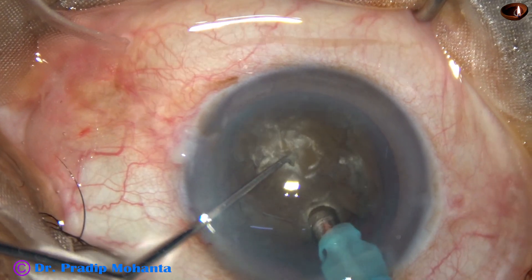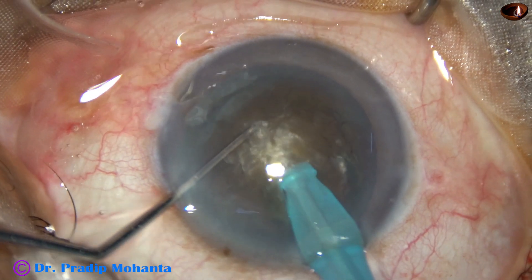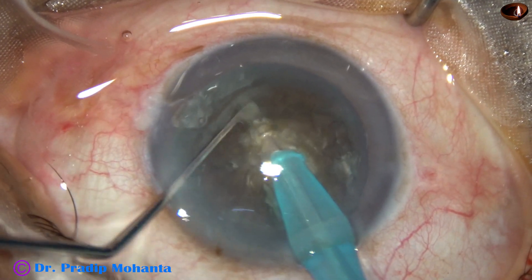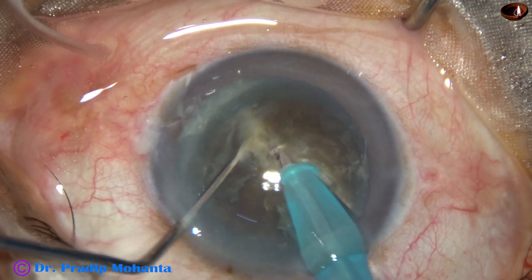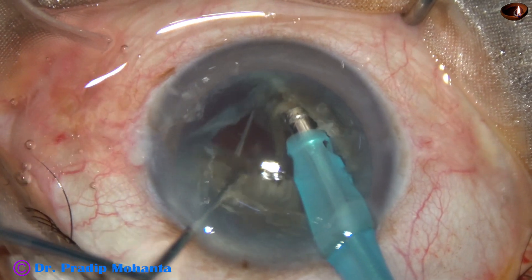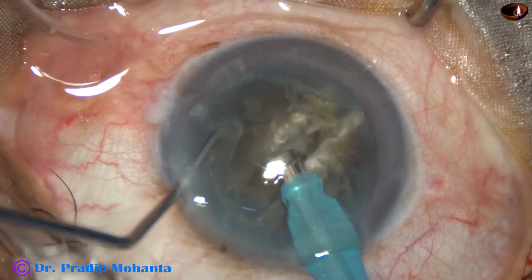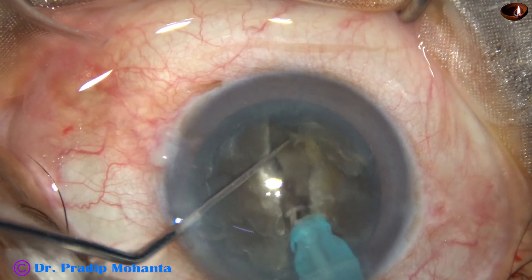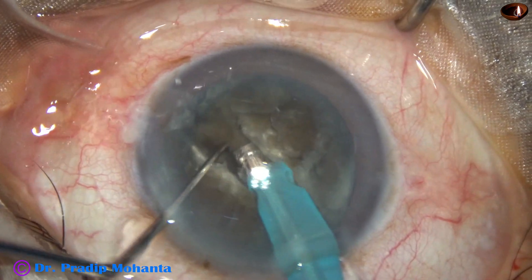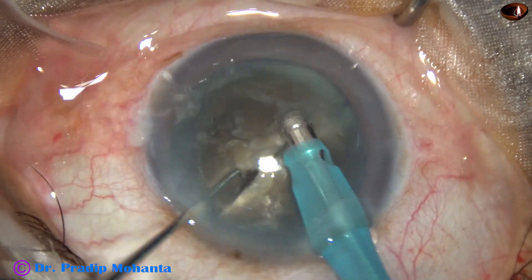The tip goes into the substance of the nucleus, travels through the nucleus towards the opposite equator. As it reaches near the opposite equator, the chopper is used to get a crack and the nucleus is separated. The two hemi-nuclei are separated. After 180 degree rotation, one or two sculpts go to a deeper level and then the two hemi-nuclei are separated completely.